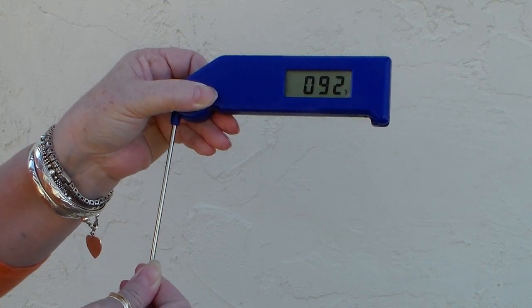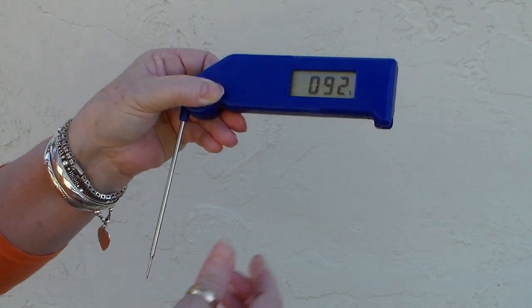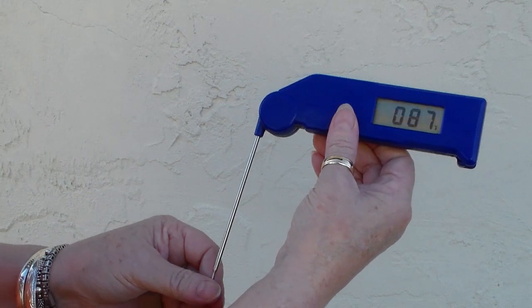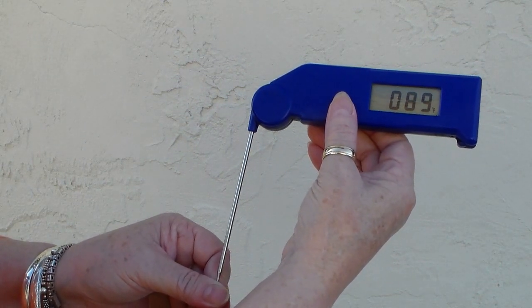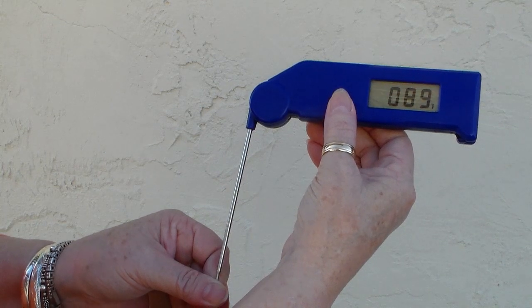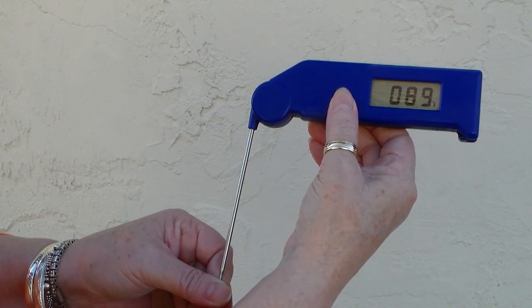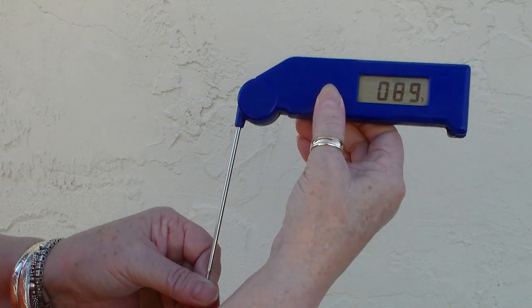92 degrees on that hand. Okay, try the other hand. And looks like about 89 on that one.